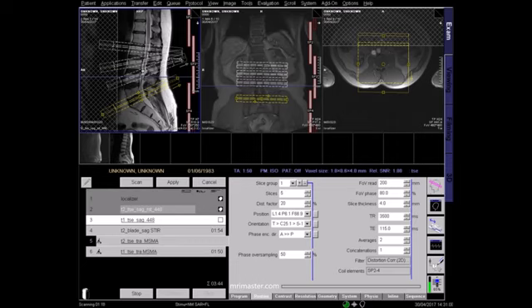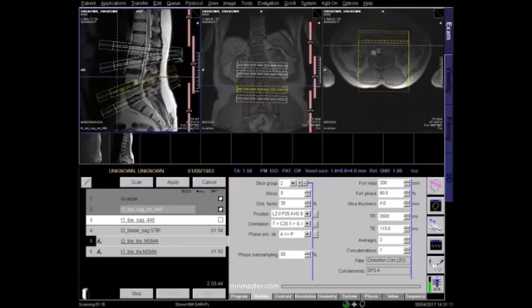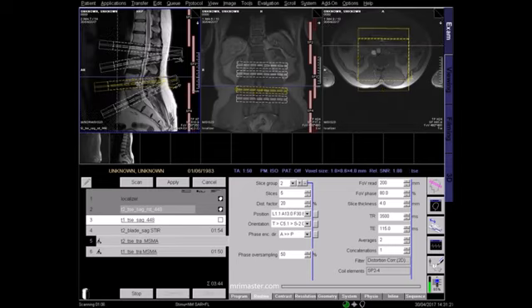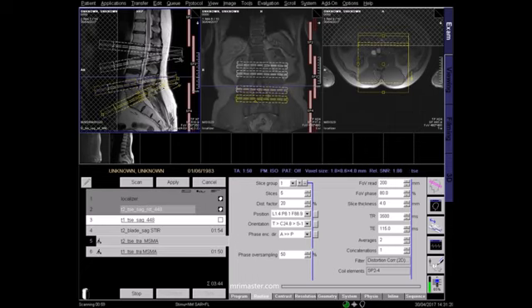It's important to avoid excessive overlap by adjusting the block angulation. Overlap between the blocks can result in crosstalk artifact, which may overlie areas of interest on the resulting images. Cover the last 4 intervertebral discs and any others that appear abnormal or prolapsed.